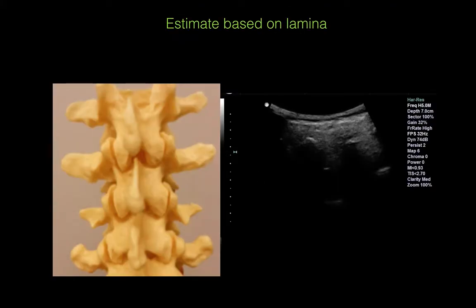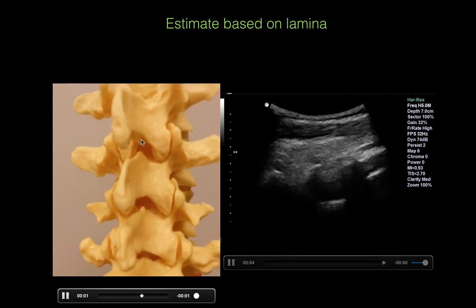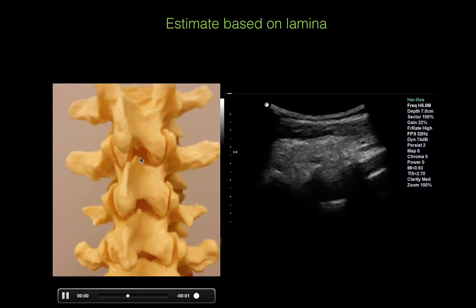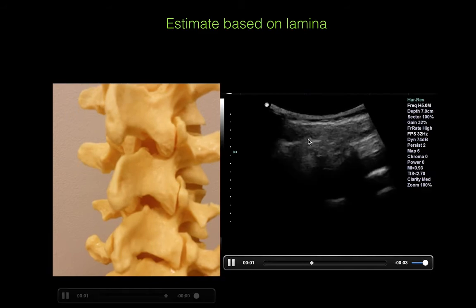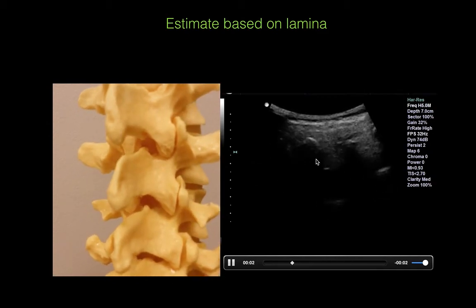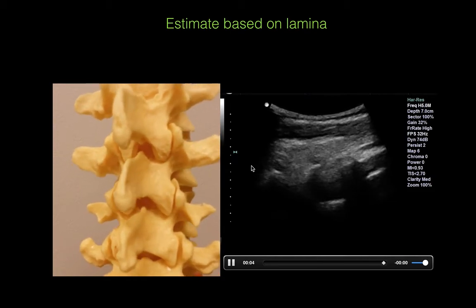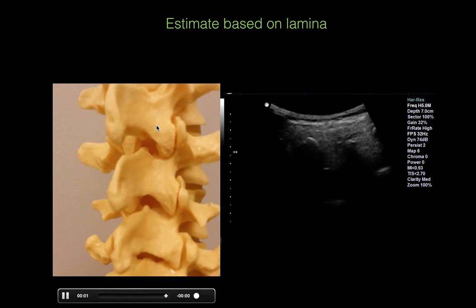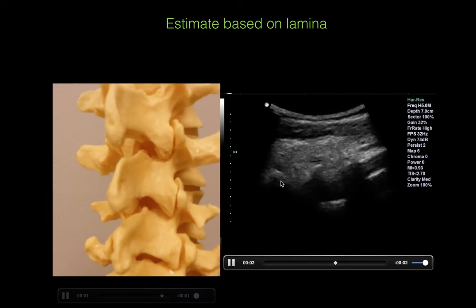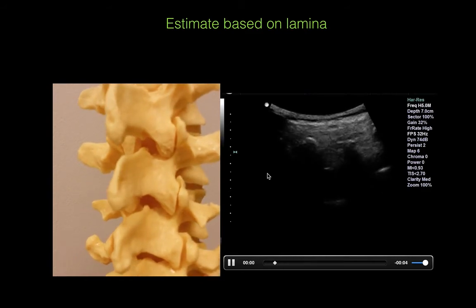The second method, helpful to use in conjunction with direct visualization, is to estimate the depth based on how deep the lamina are. If you rotate the view slightly, you can see the lamina, and that would be approximately how deep your needle wants to go. You can see the spinous processes at the top, and then as you image laterally, you can see the scalloping structures — those are the lamina. Keep in mind that because you are imaging at an angle, you are overestimating the distance, meaning you never really want to insert your needle deeper than that measurement.